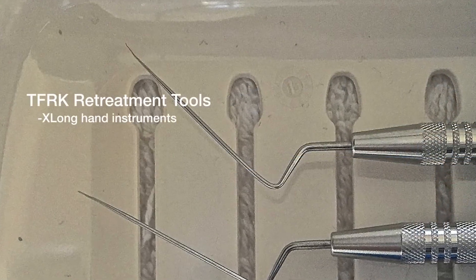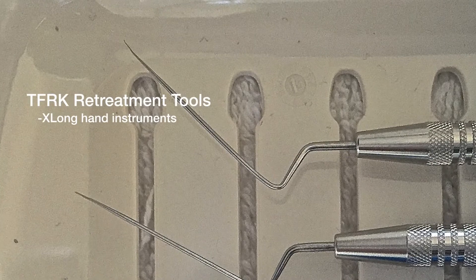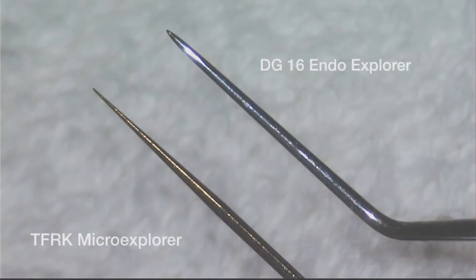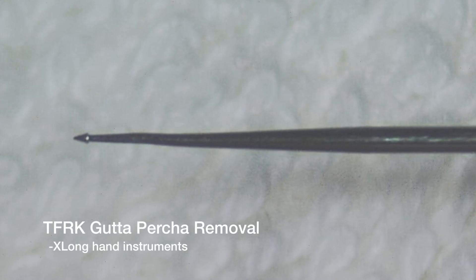Also in this underneath section are two hand instruments that are especially helpful for retreatments of all types. There is the Ultrafine Explorer Tip — these are very long tines that can go down the cuspid. There's also a very cool gutta-percha remover that has an arrowhead on it, like a spearhead with a barb on the backside, that pulls gutta-percha out very effectively.